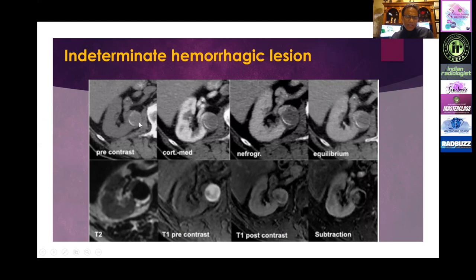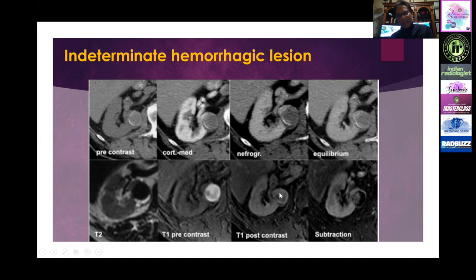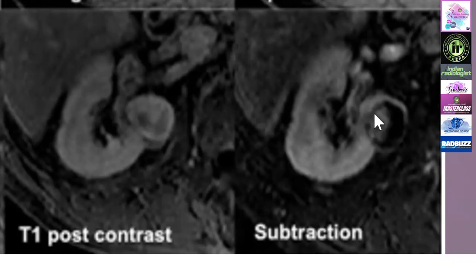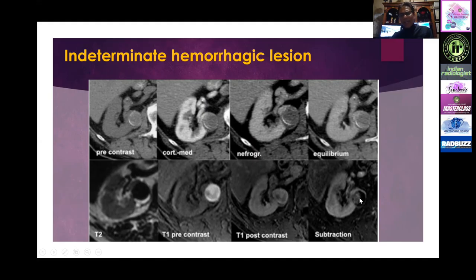For example, in this patient, there is a lesion with slightly hyperdensity and peripheral calcification. Following IV contrast, there is no way of measuring how much this lesion is enhancing. On MRI, on T2-weighted images it is hypointense, and on pre-contrast it is markedly hyperintense indicating hemorrhage or proteinaceous material. With IV contrast you cannot determine whether enhancement is present, but on subtraction you can see an ugly nodule within this cyst, which was a papillary renal cell carcinoma — difficult to diagnose on CT or non-subtracted images.